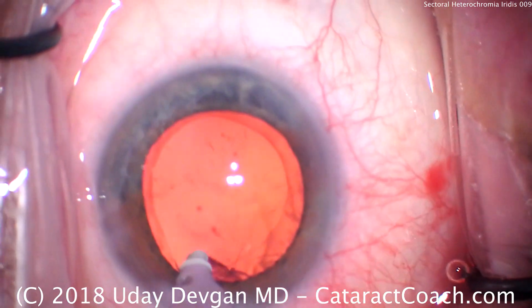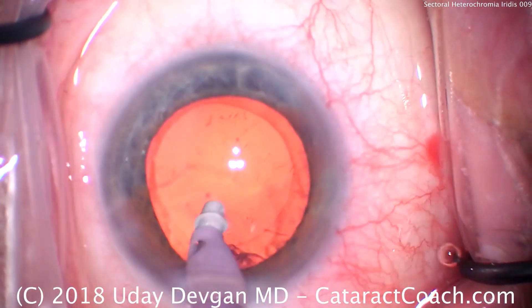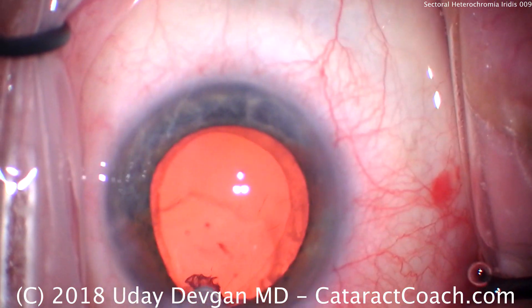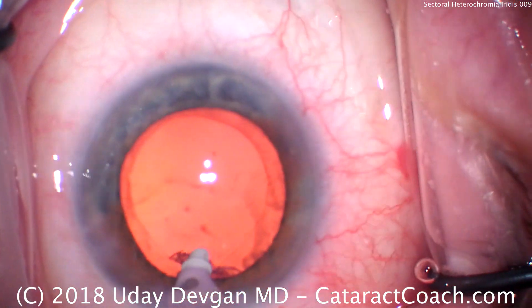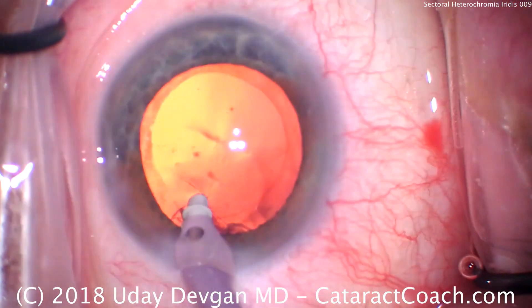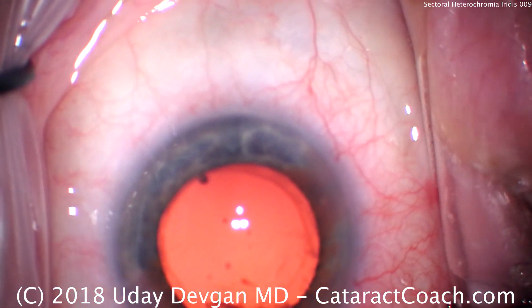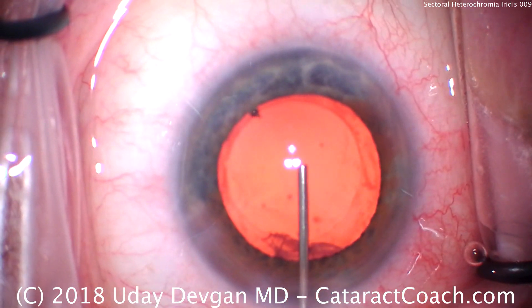Now there is some subincisional cortex which we can't quite get out just yet. That's not a problem — let's leave it be. Put the lens in, and after the IOL is in the capsular bag, then we can remove that last bit of subincisional cortex. The beauty of putting the lens in first is it'll weigh down the capsular bag and push the posterior capsule away from us, so we can grab that subincisional cortex without worrying about the posterior capsule.